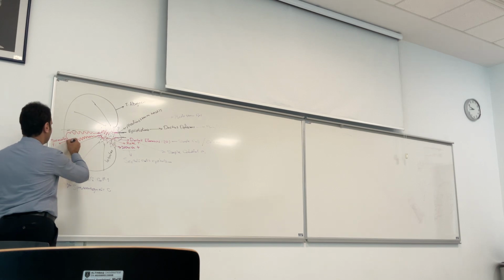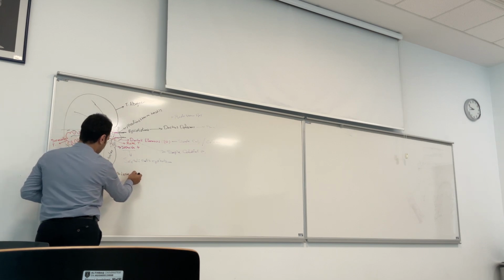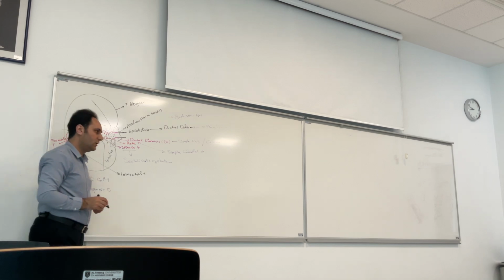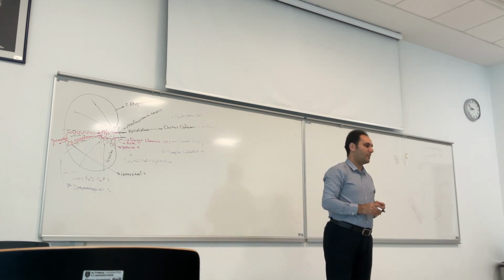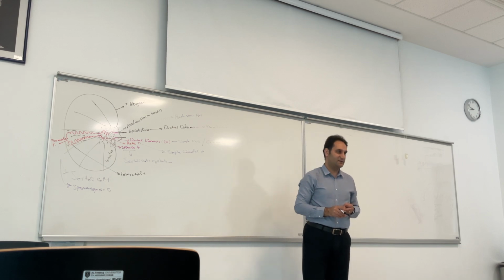This is known as the interstitial tissue. In the interstitial tissue, we have connective tissue, blood vessels, and a high amount of lymph vessels.